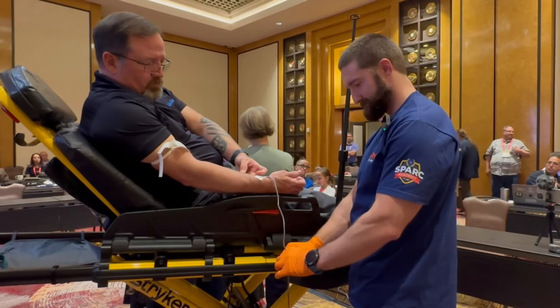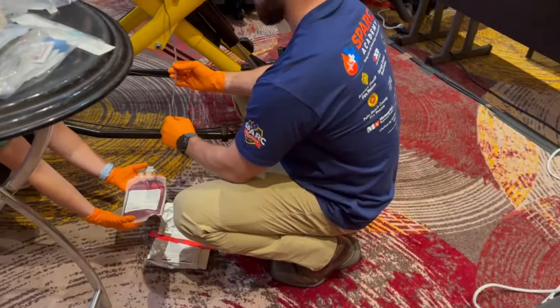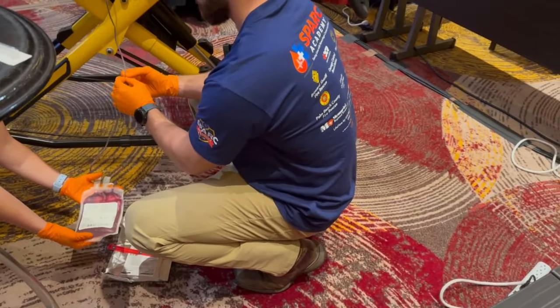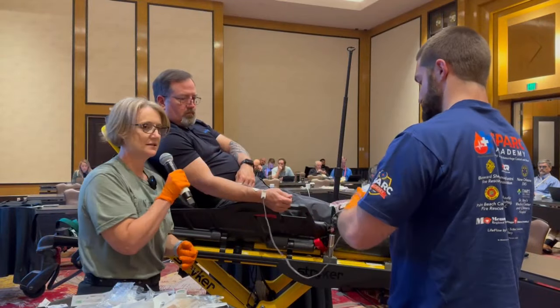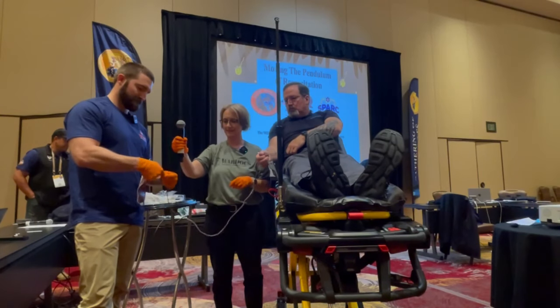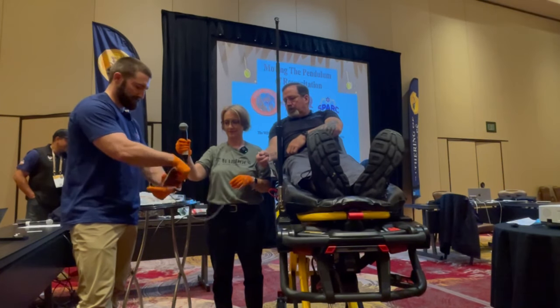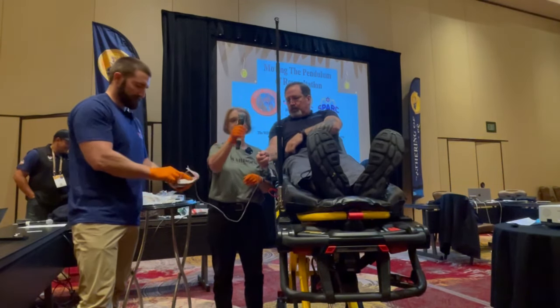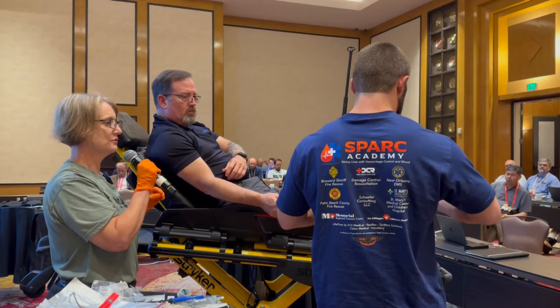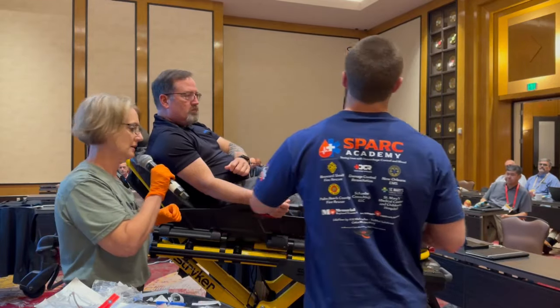If you're an EMS agency and you want to start blood but don't know who provides blood in your area, look into your regional blood supplier. Blood cannot be transfused via your regular IV tubing — it's not the same as saline tubing. It needs to go through tubing that has a filter in it, in the event that any clots have formed.